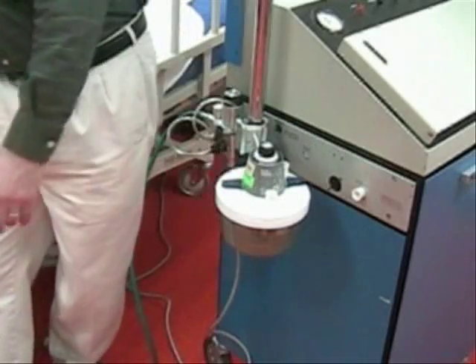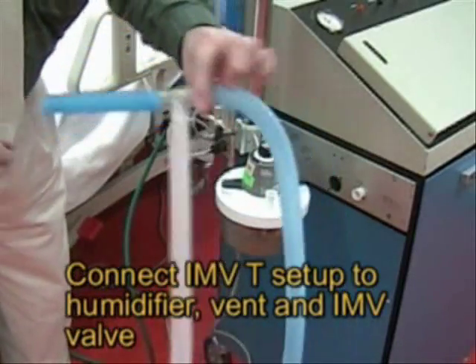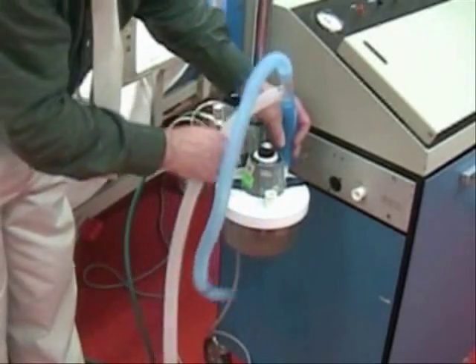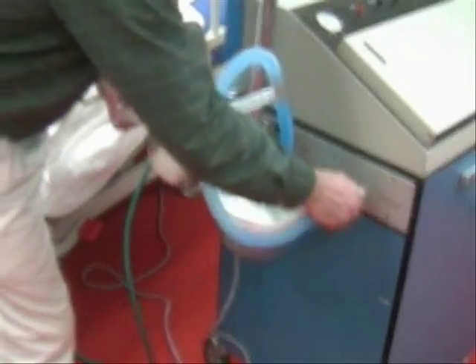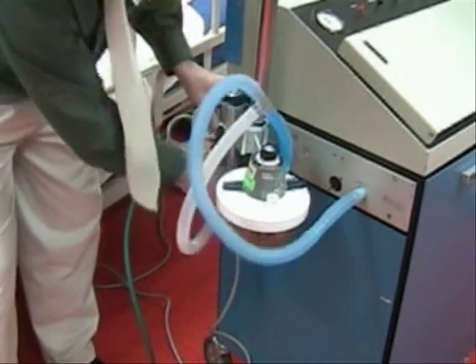Next, we're going to put on the T-system so that we can adapt the IMV system. We're going to place one connection on the humidifier, one to the ventilator, and one to the IMV.